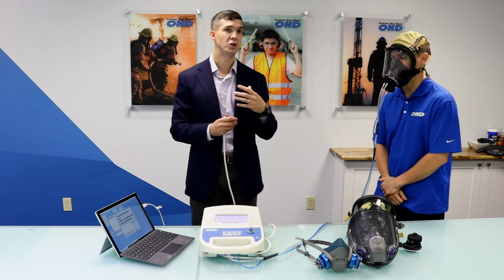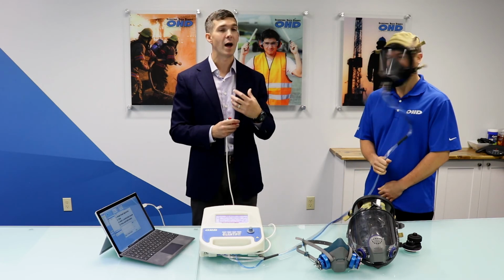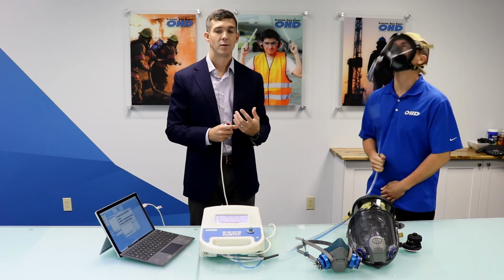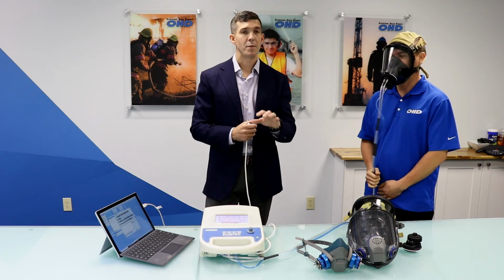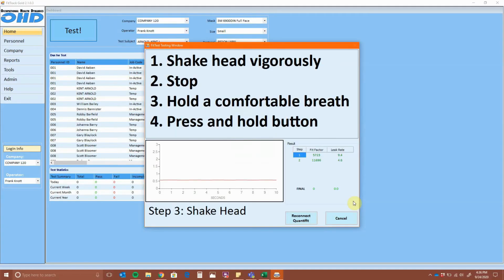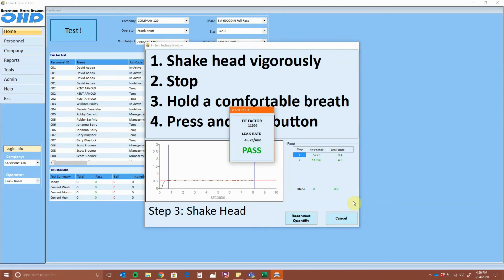Now what he'll do is shake his head vigorously, left to right, up and down. He's going to talk out loud a couple of seconds. 1, 2, 3, perfect. 4. And then stop. Now what we're looking for there is, does the mask reseat? When you're ready, you take a breath and hold it. Perfect. So what we're looking for again is, does the mask reseat? After you shake your head up and down, talk, how does that mask reseat to the face? So we have a great score here.